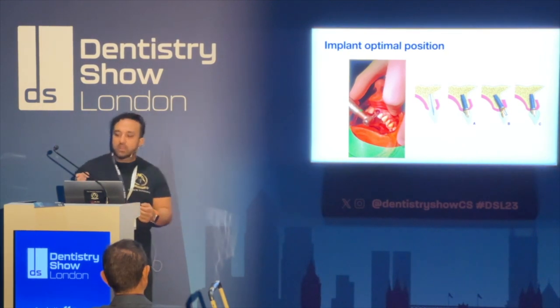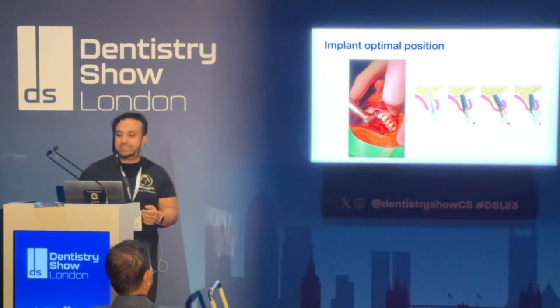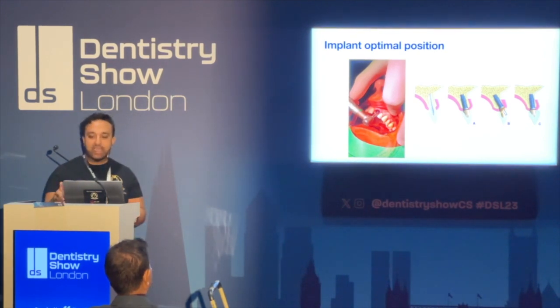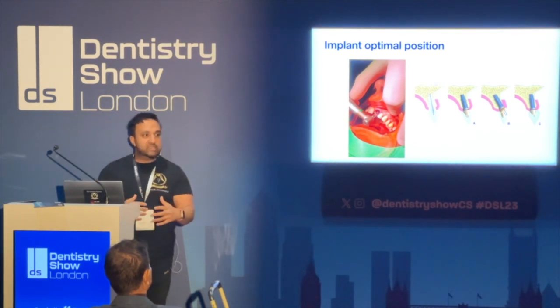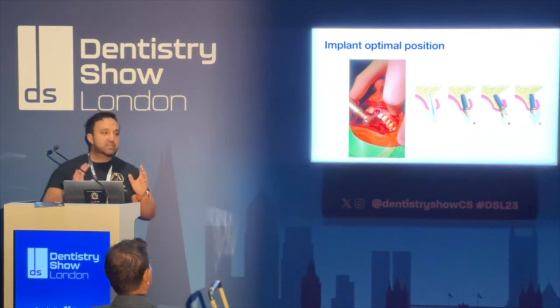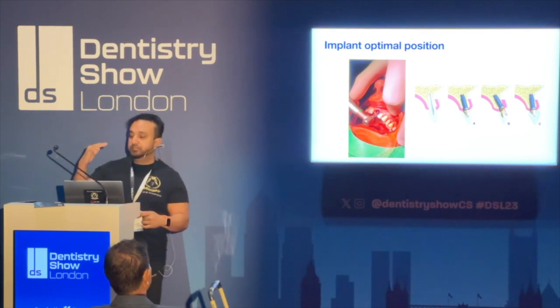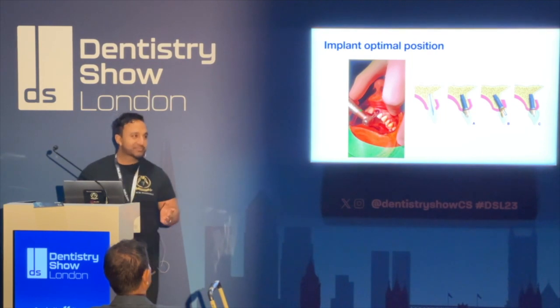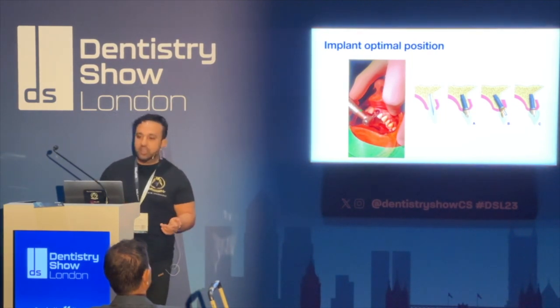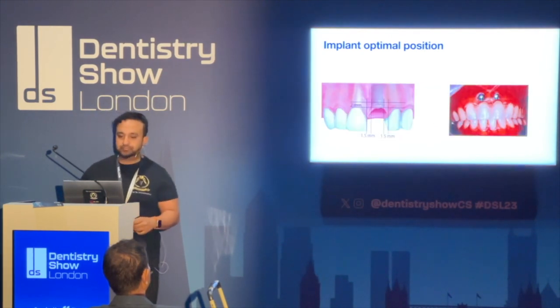As you can see, on image number C is where an implant's been placed quite late after a tooth has been taken out. And what do you notice? The amount of ridge overlap that's going on, right? The implant is in the suboptimal position because the bone has gone. And someone's thrown this implant in, and you've just got this big crown going forward, and it's a disaster. It can cause most of the problems. So early referral for immediate implant is really, really important.